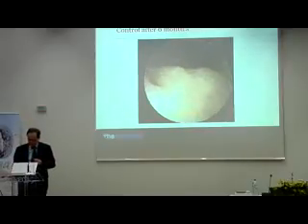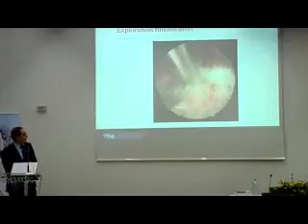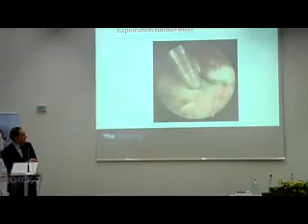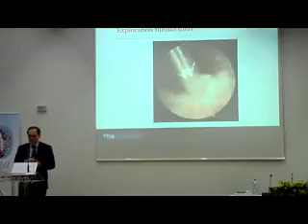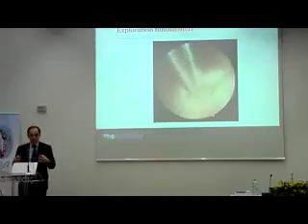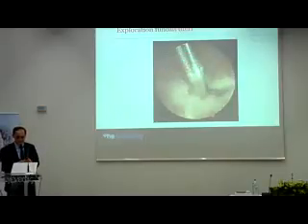Okay, now let's have a look. First we look in the upper part, and we see if we drop the pressure, too many vessels. An embryo cannot survive here, we think. And so let's explore this. The blunt scissor, there is no risk. And the Belgian chocolate, what does it do in the womb? It induces the immune system. It is irritating blood in the muscle, and you get all the immune competent cells coming. You get the hypervascularization, which is a sign of an immune process, and she will not get pregnant.